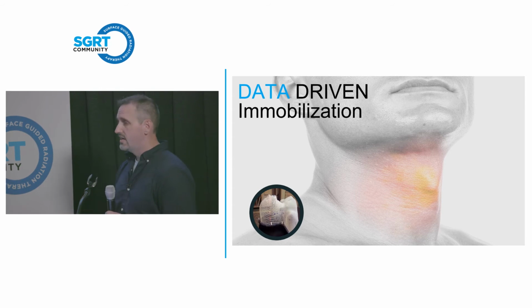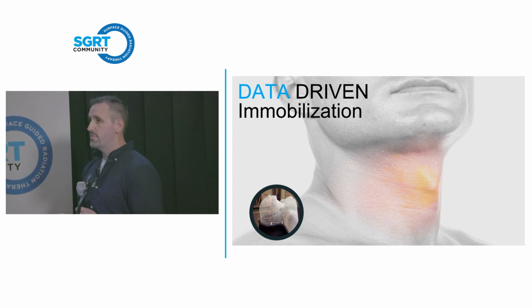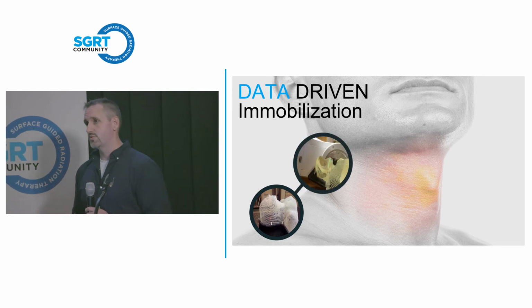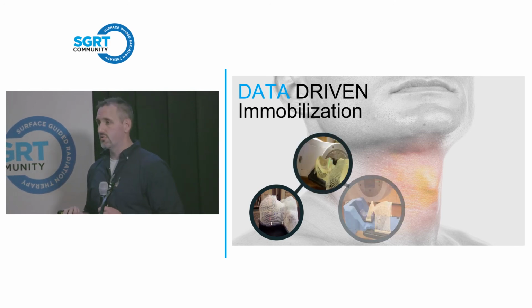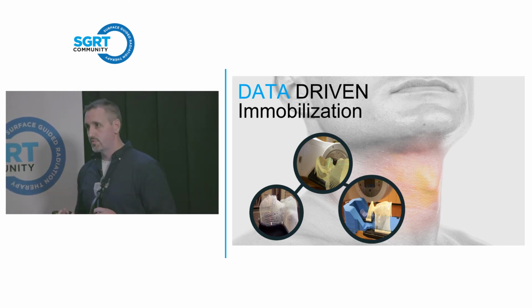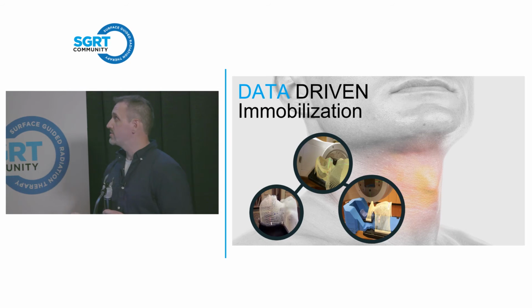So we thought, well, can we correct the C-spine curvature and reduce the amount of replanning that we're doing? So we went to open face masks. Then we went to these because we're like, well, now we're correcting the C-spine. Now we can kind of correct the shoulders. Let's give another mask that we can put them in a nice, comfortable position, but also be able to adjust their shoulders. So we did that.